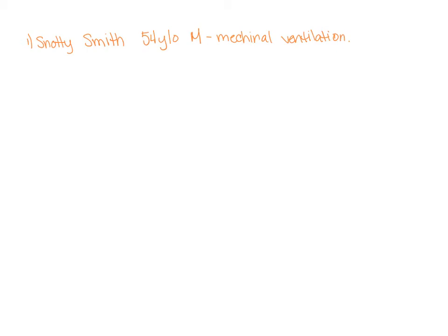So the best choice for Snotty Smith is going to be a Passover and/or wick humidifier. So either one of those would be correct.